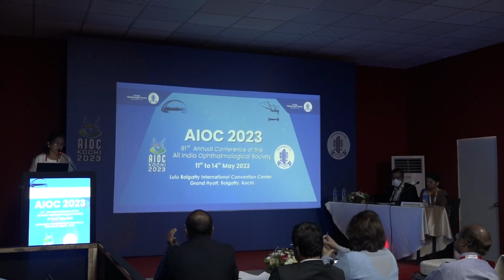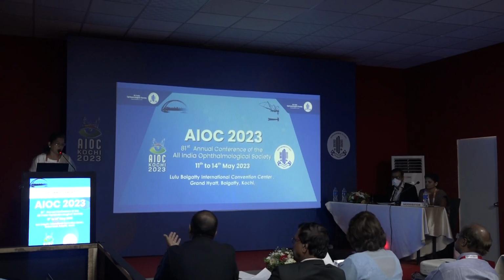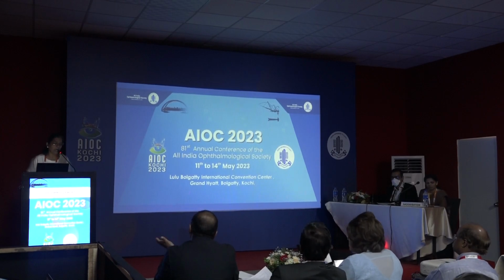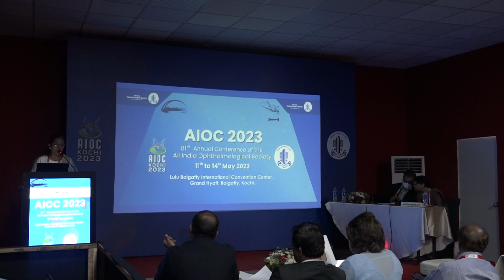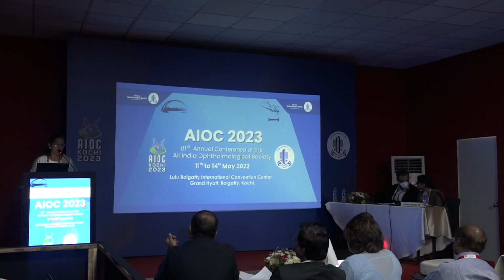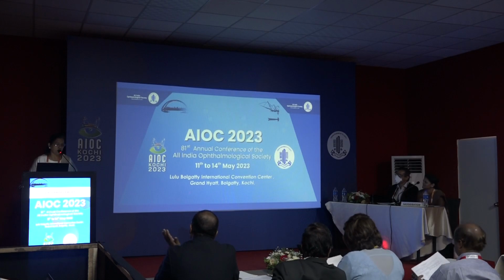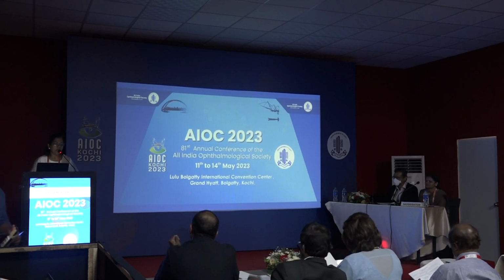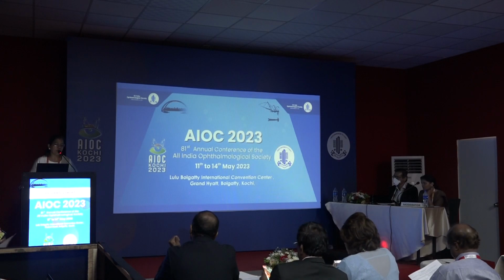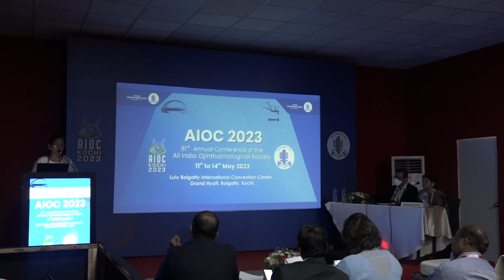And another question: you have showed us great images, but do you have artifacts happening when you do peripheral viewing? Because this is an issue which these kinds of portable devices have. No, I have captured the ora and the lattice and barrage laser holes. Even I have captured the white without pressure areas. Yeah, I saw those laser holes and others. So you feel you don't have too much of an issue with artifacts, especially with peripheral viewing? Peripheral view lens artifact is there with every machine also, that you can remove with PowerPoint or any image editing app. Okay, thank you.